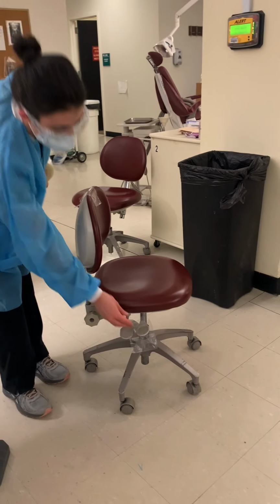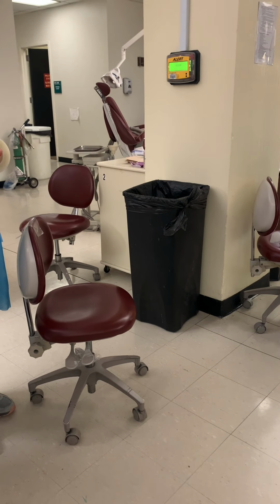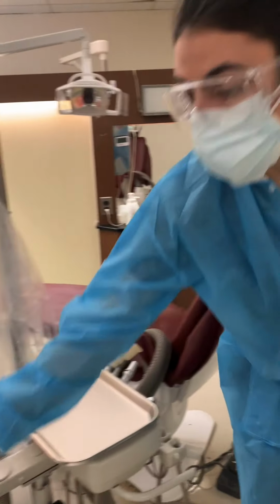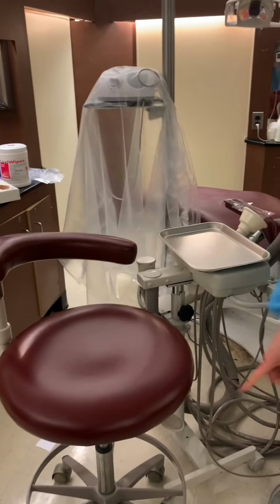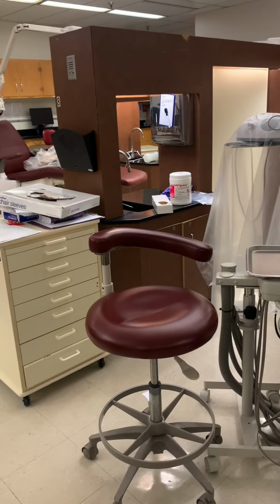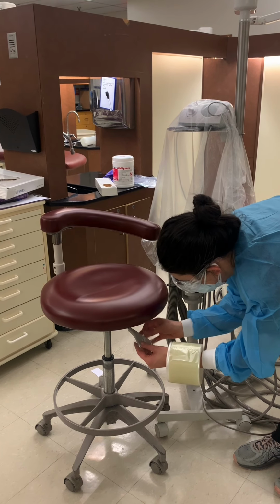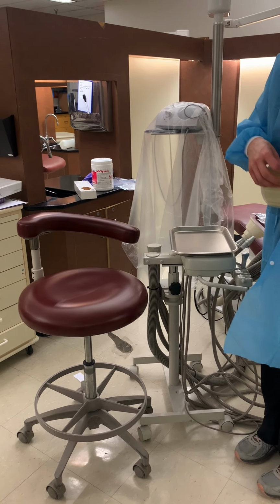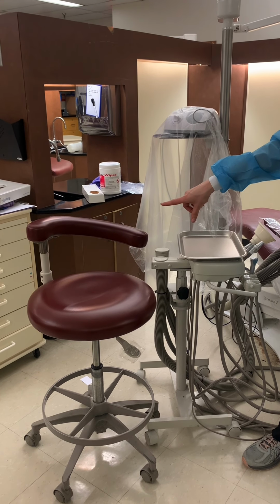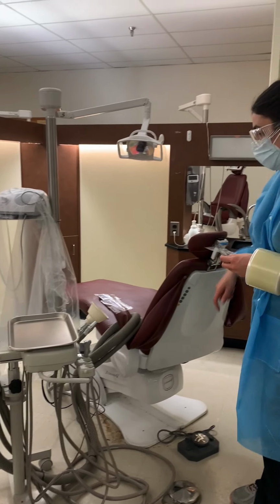There's so many little nooks and crannies inside there, it would be really hard to spray and wipe. Same thing on your stool. Let's say if you want to move your stool up and down, give yourself a little lip as well, and same thing. And then also for your stool, actually we'll cover the whole bar with the chair cover instead, so we won't put this on there, okay? We'll cover the whole bar with that.